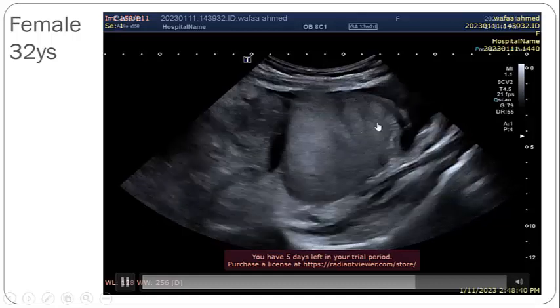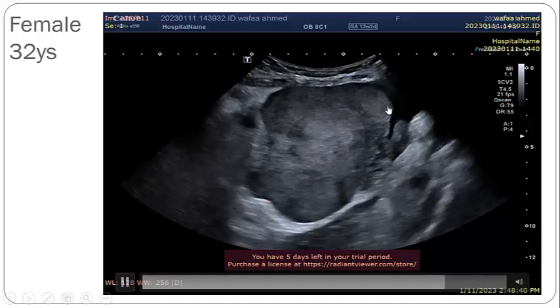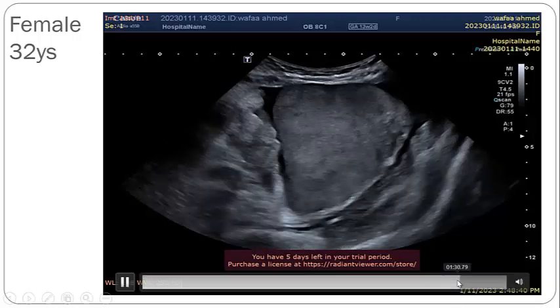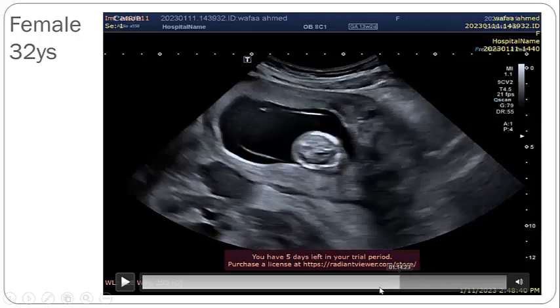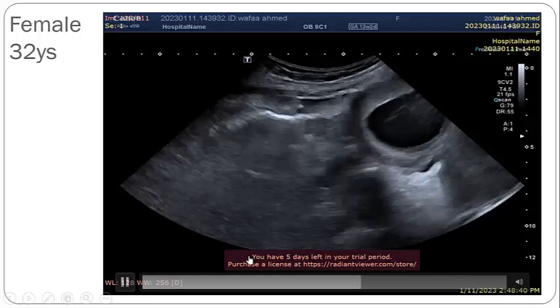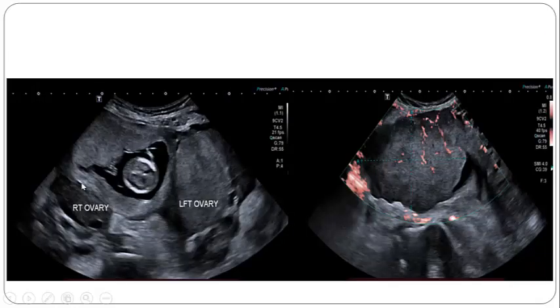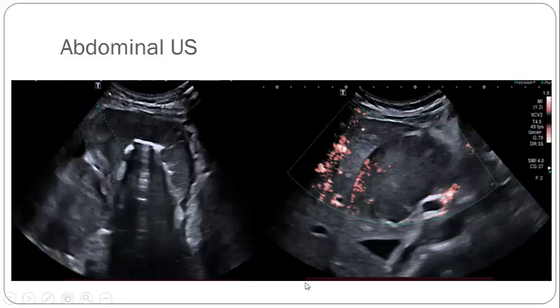When we do pelvic ultrasound, you find there is fluid, mild ascites seen here. So you have to look at the upper abdomen. Here there is mild ascites, and here also we find something that is worth diagnosis: in the other ovary there is a follicle spared. There is a spared follicle sign. Then on going up, these are the bilateral ovarian masses, solid with follicle sparing, and when we put Doppler, it is highly vascular on color Doppler with malignant circulation: lack of arborization, arteriovenous shunting, large central vessels.